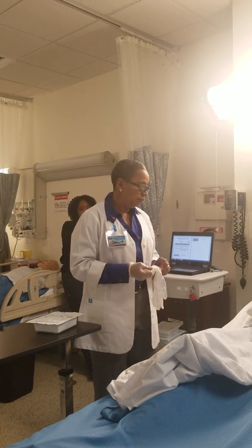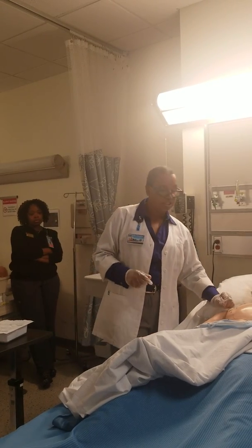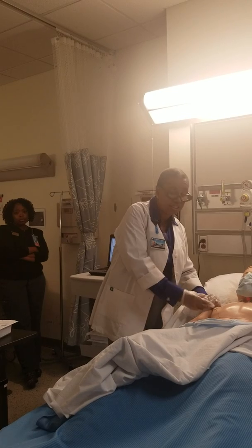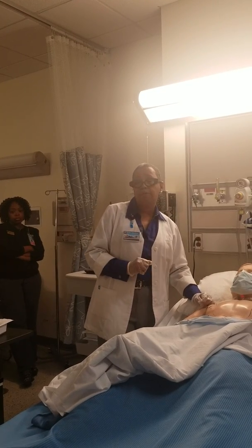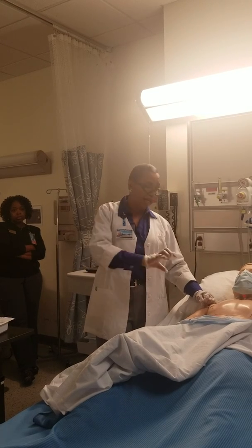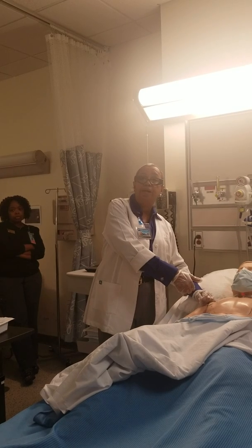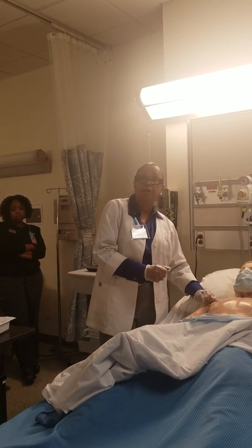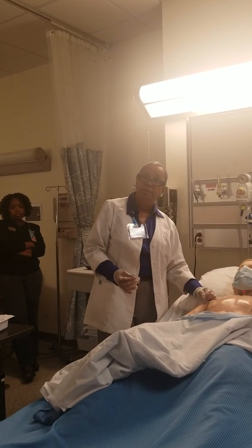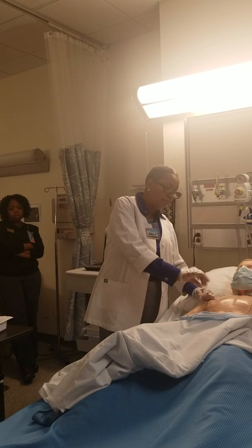So I'm going to come up and inspect this. They have caps here. You have protocol on these caps because these caps can be changed. Most times there's a protocol to change them every 3 days or after every infusion. A lot of times they have a green port and you just twist the green cap off and put a new green cap on. So you need to know about your caps as well, because they twist off, and then you can put them back. Like I said, you might be changing the cap.